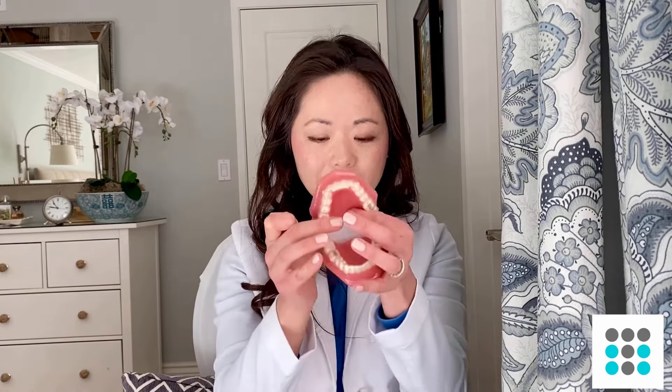I usually tell my patients to keep one of these chewies inside their aligner case so that they always have access. What you would do is seat your tray, then use your chewy to chew it into place. I usually recommend chewing for five minutes — you can chew in different areas, or if you have some trouble areas in the front, keep it in that area and squeeze and hold for five to ten seconds and release.